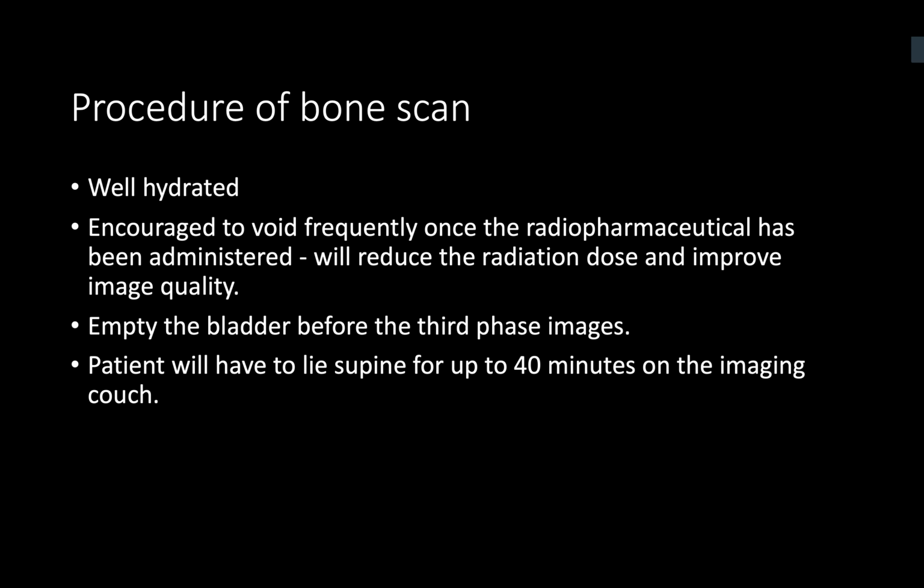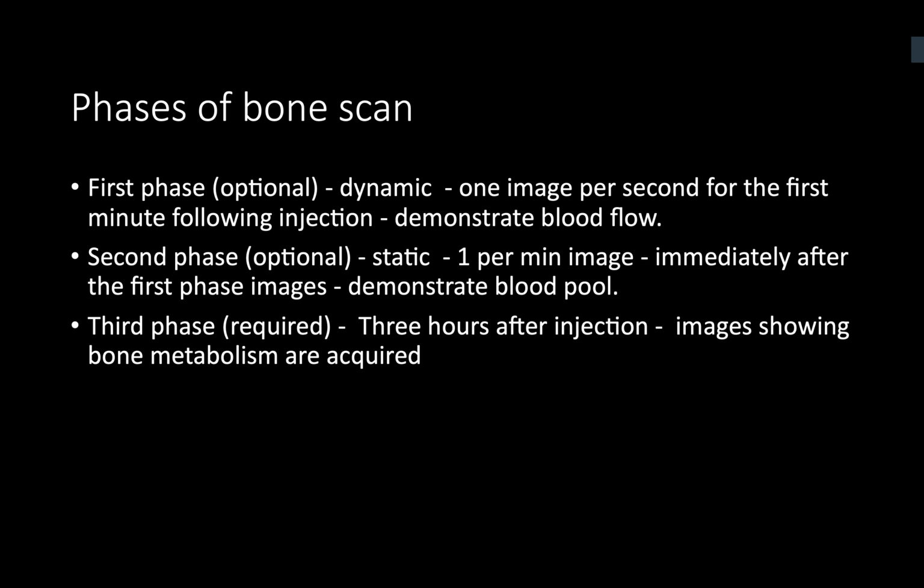Because the technetium half-life is 6 hours, I'm not sure whether we have to stay away from the pregnant women, but I'll confirm that later. I haven't read something like that for bone scan. It's only 6 hours, the half-life of technetium. And because these emit gamma rays, and it's mostly diagnostic, it is not as problematic going near to pregnant patients, as I believe, but I have to confirm that.